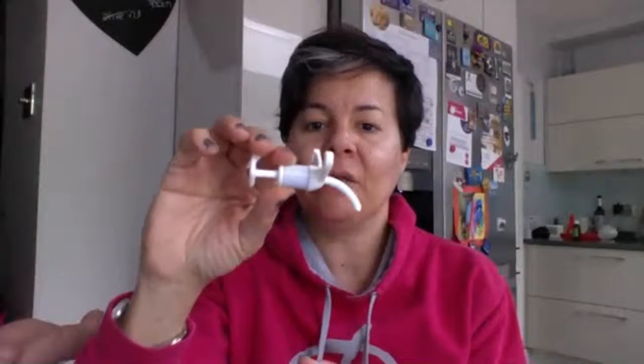A tracheostomy is used when a child or a person or an adult can't breathe through their nose or mouth. And in Zoe's case, she was born with the back of her throat completely blocked. So I don't know if you know this, but the nasal cavity passes into your trachea at the top, and then it's just all one big hole. So when it was blocked at the back of her neck, both her nose and her mouth were blocked. So essentially she started suffocating the moment she was born. And this little beauty was put in to give her an airway.